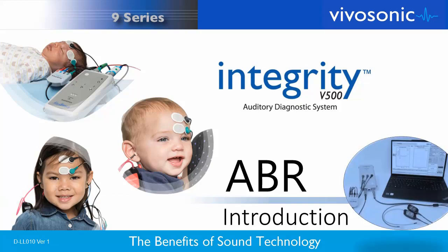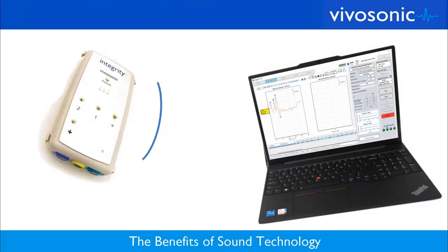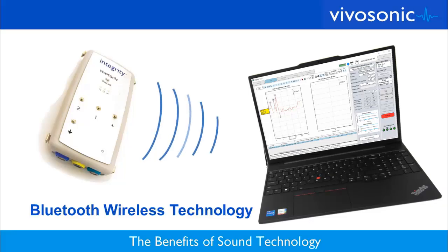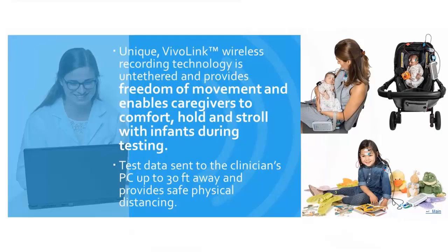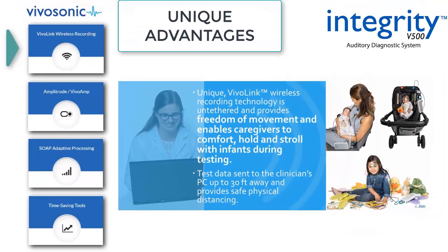Introducing Vivosonic Integrity ABR. Vivosonic's Integrity system works via Bluetooth technology. Bluetooth technology allows for portability and flexibility while testing. Infants can be carried, rocked, or cradled during testing without interfering with the testing process.